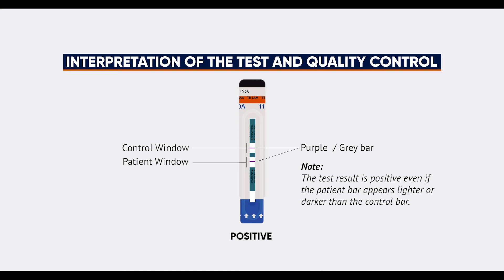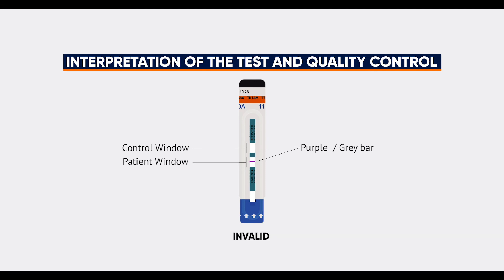Note: the test result is positive even if the patient bar appears lighter or darker than the control bar. If there is no purple or grey bar in the strip's control window, even if a purple or grey bar appears in the strip's patient window, the result is invalid and the test should be repeated.